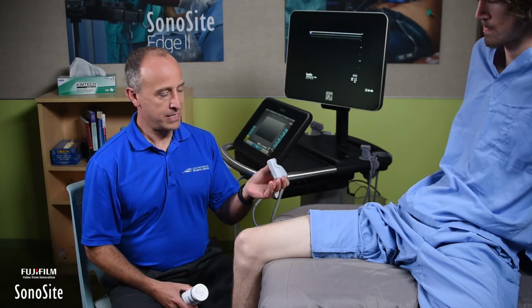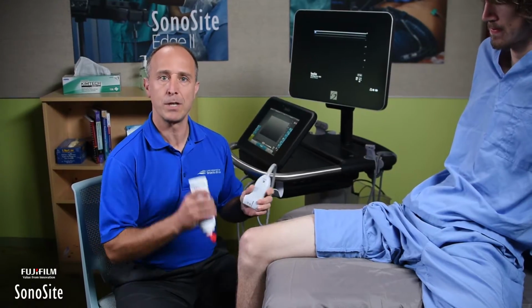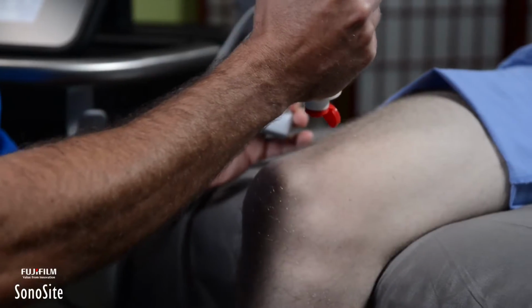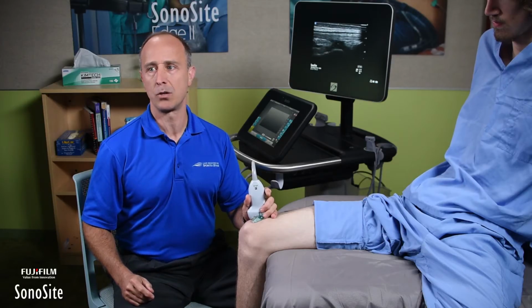So first I'm going to take this probe, which is a 6 to 15 megahertz probe, linear array. I'm going to use copious gel at the anterior knee. And I'm going to start by looking at the suprapatellar recess.